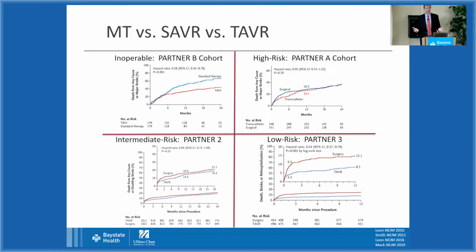If you come in with a blocked valve, you're going to get a transcatheter valve unless you've got some other reason. Okay. Now, transcatheter valve replacement is also a lot easier than surgery, right? Surgery, big open heart surgery, takes 6 hours. You're in the hospital for a week. You feel like a train hit you for a month. Transcatheter valve replacement is a much easier deal, right? You're in the hospital overnight, the procedure takes an hour.